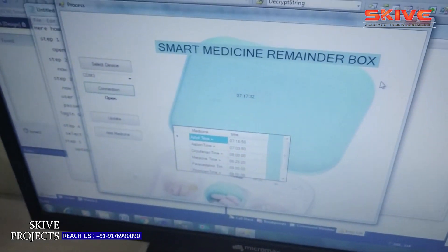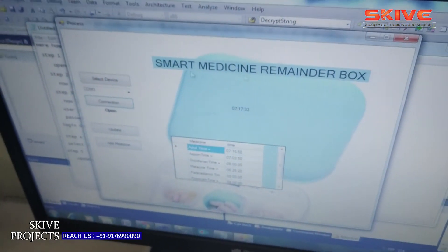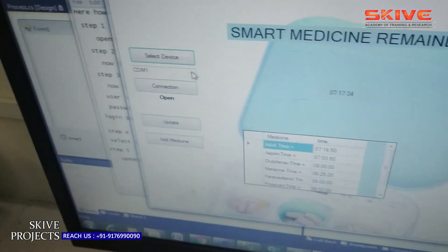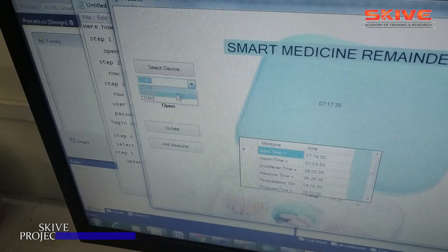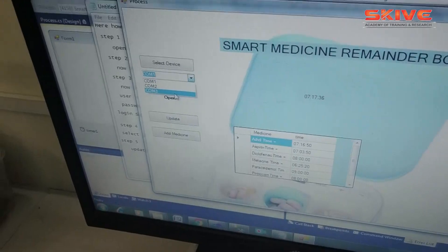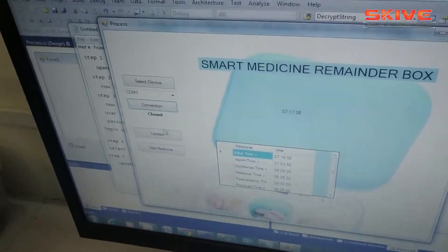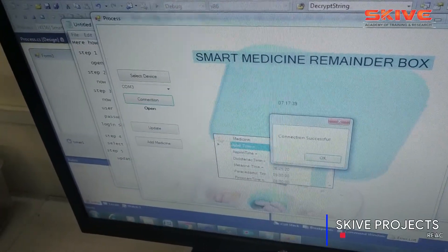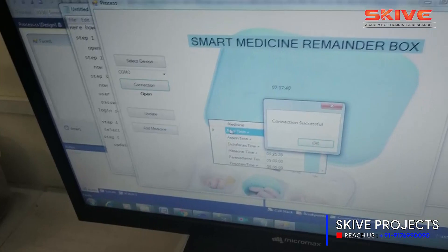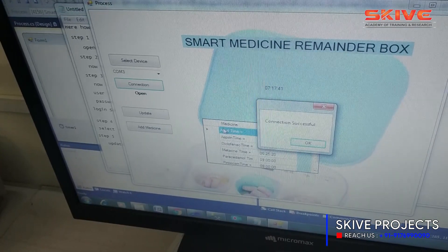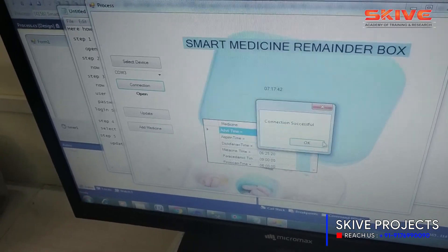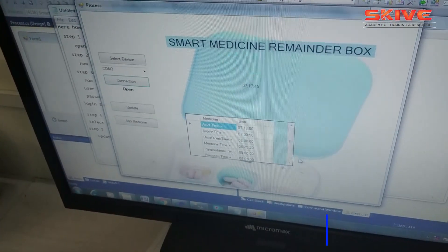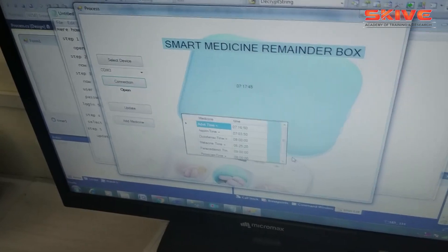In the software section, we designed a UI where you can set up the time and the medicine. The basic concept is that in the software end, you can configure at which time which tablet should be taken.